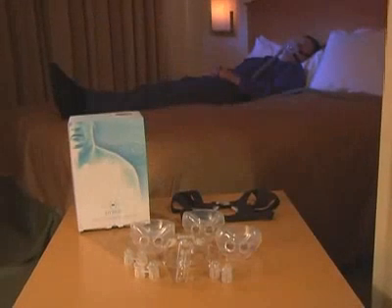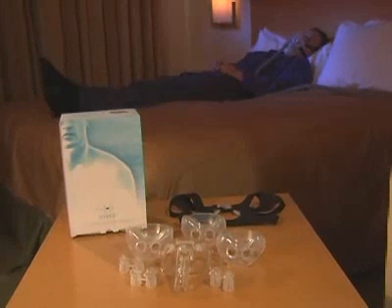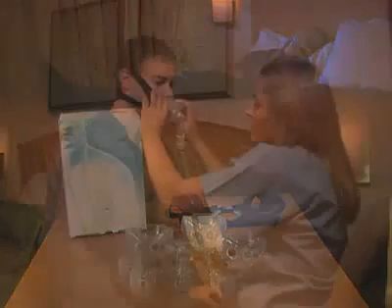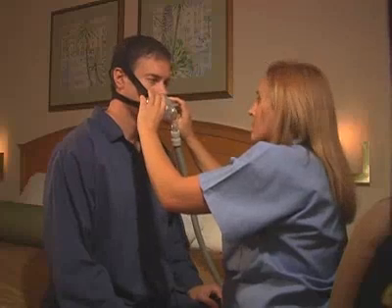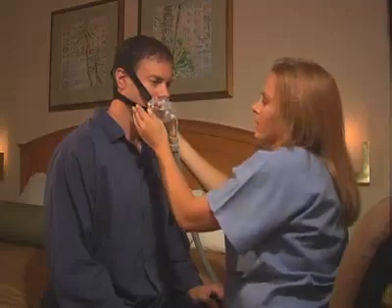Each individual package contains all of the components required to properly size the patient, eliminating the hassle of opening multiple products to get the right fit. The hybrid is suitable for multi-patient use in the clinical setting, provided proper cleaning procedures are followed.